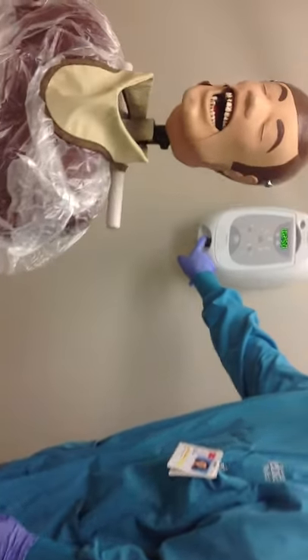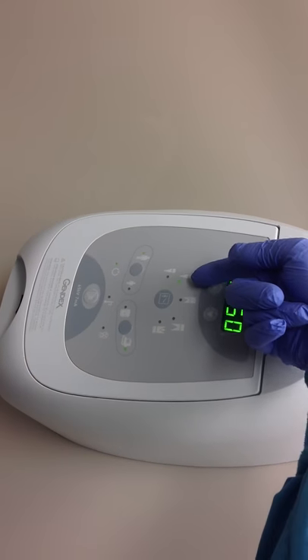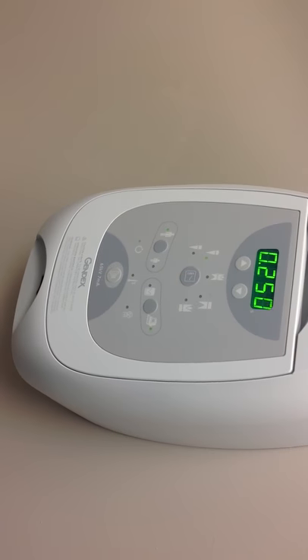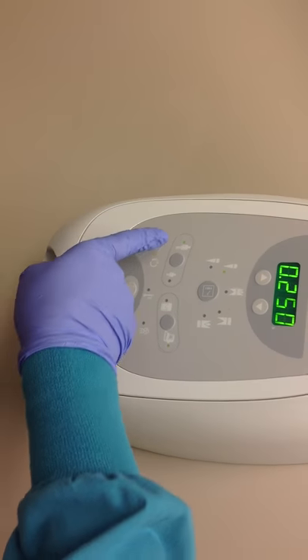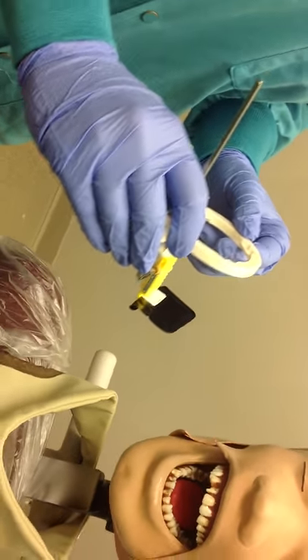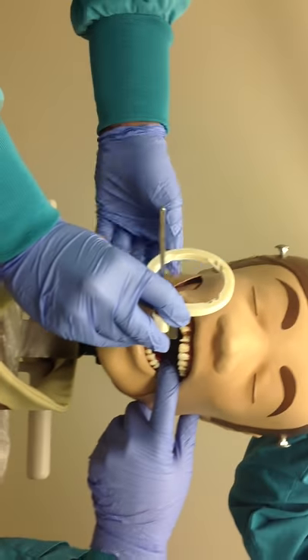Turn on the machine and make sure the settings are correct for the appropriate radiograph. Select the premolar option. Based upon the patient, select the adult or child option. Insert the phosphor plate in the patient's mouth and position the XCP with a horizontal angle parallel with the contact between the premolars.